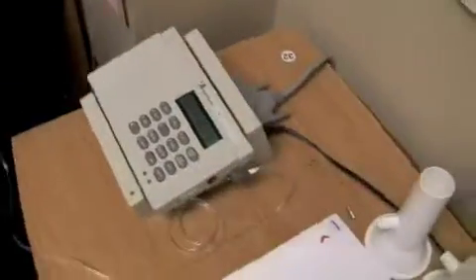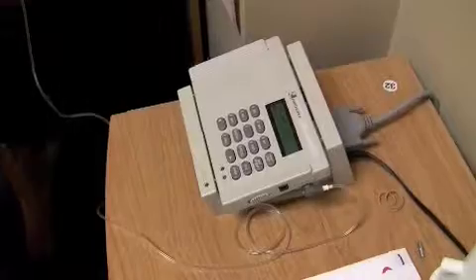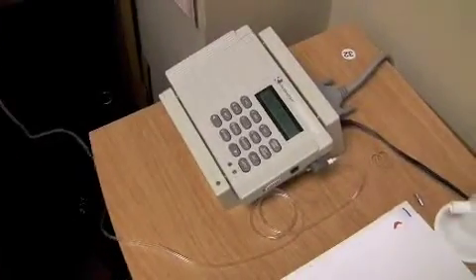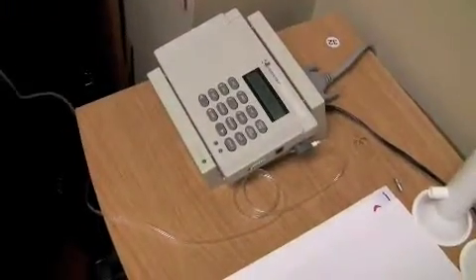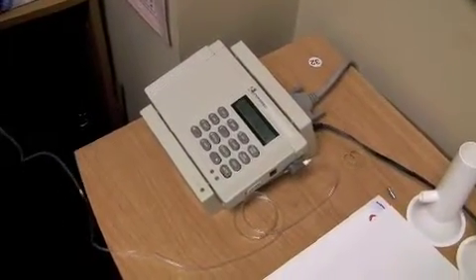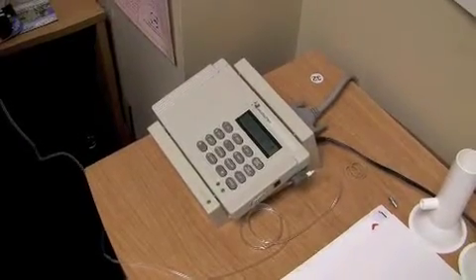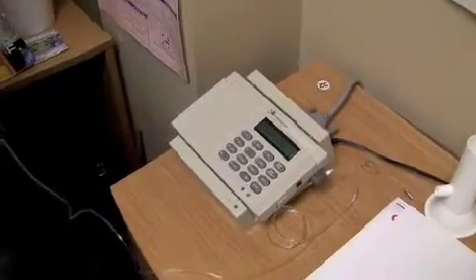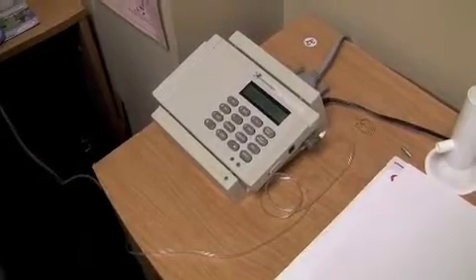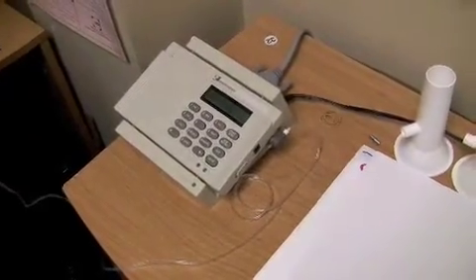What's going to happen is there's not a set number of tests that I know of that we can do. I had one gentleman that gave me 13 tests, and he finally got a good test. When you get a good test, the machine will tell you "good test." At that point, the patient is done. At this point, what you have to do is initiate the printing procedures to print this out onto the printer.